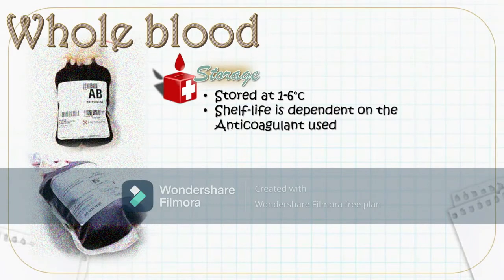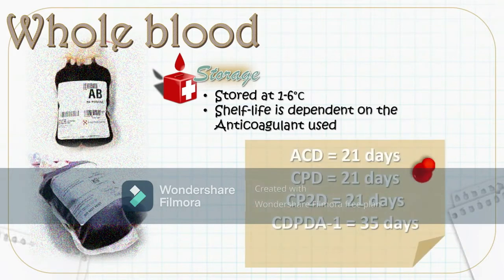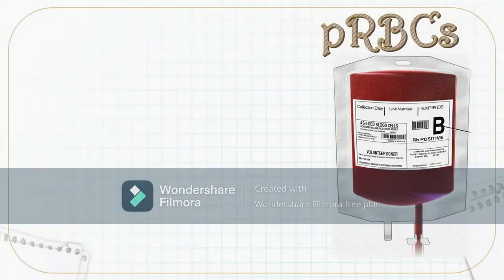If you could remember, there are several non-toxic anticoagulants used, such as the following. So we have your acid citrate dextrose, your ACD, your CPD, your CP2D, which will give our whole blood unit a shelf life of 21 days, and we have your CPDA1, wherein with this anticoagulant, whole blood units will have a shelf life of up to 35 days. Next, we have our packed red blood cells, or our PRBCs.